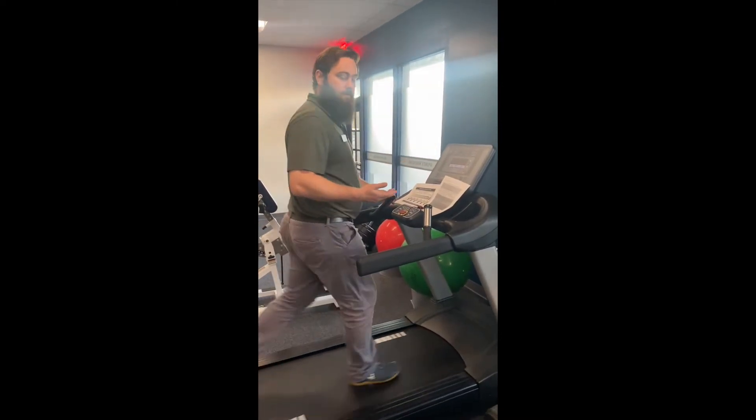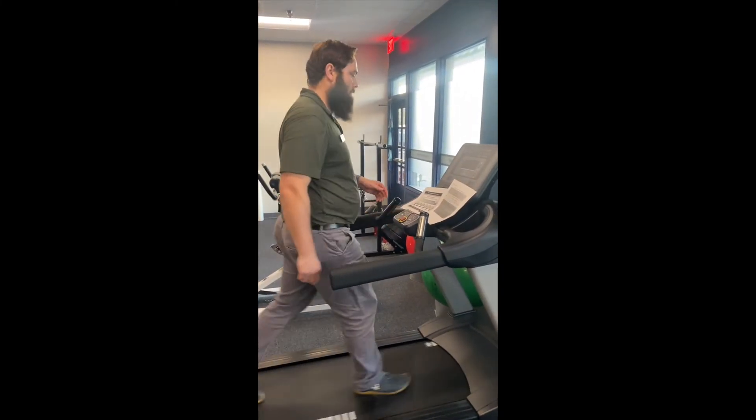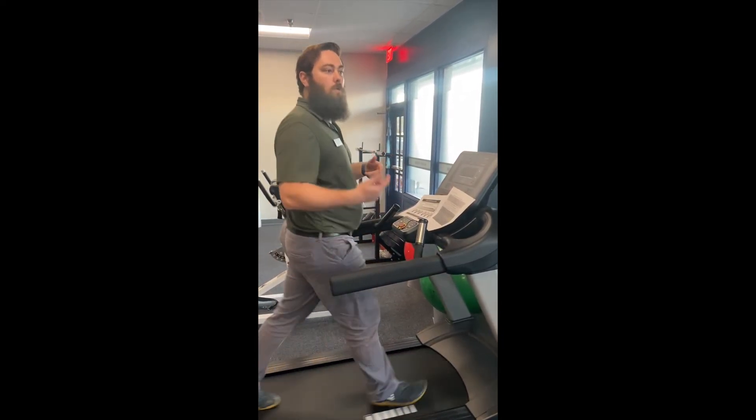Make sure they do it carefully. After a minute of walking, you will increase the incline and take the heart rate again, the RPE, visual analog scale, as well as any new or recurring symptoms.